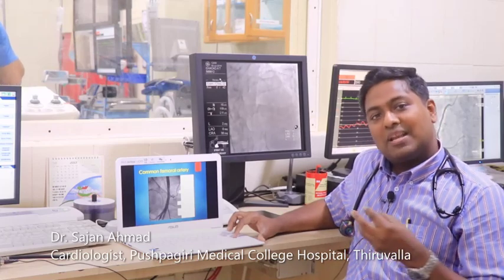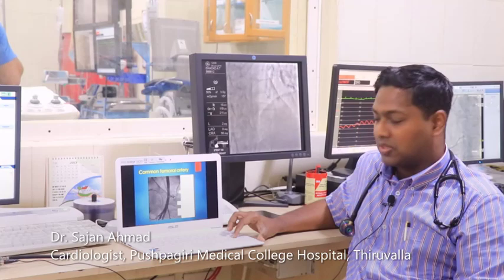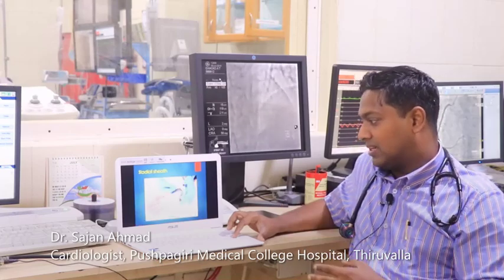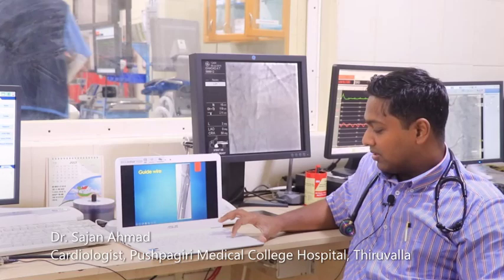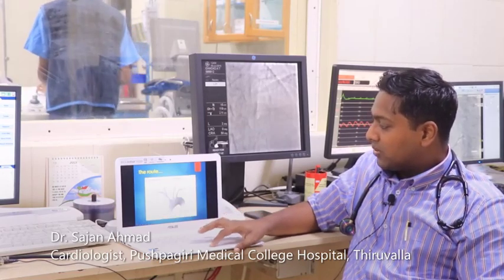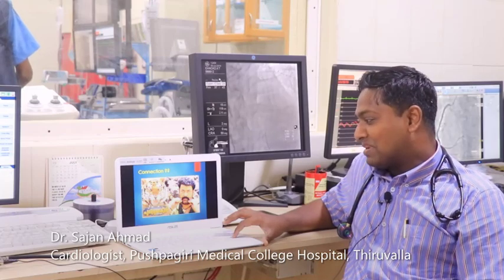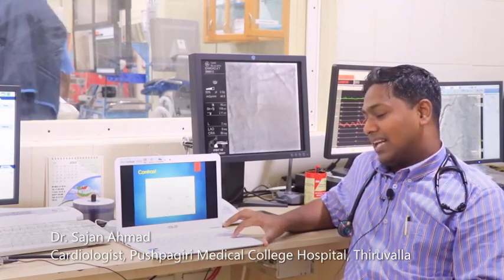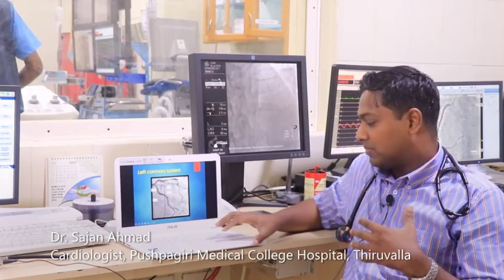I am doing an angiogram using a sheath tube inserted in the arm. A wire is advanced through the arm. Using a catheter — in this case a type called a Tiger catheter — we inject contrast material through the tube into the coronary arteries. Once we inject the contrast, the image appears on the computer screen showing the coronary vessels.